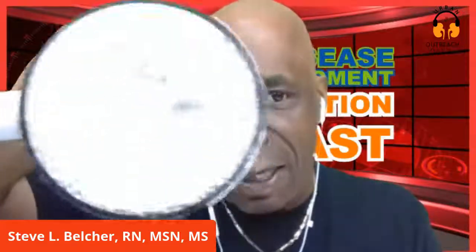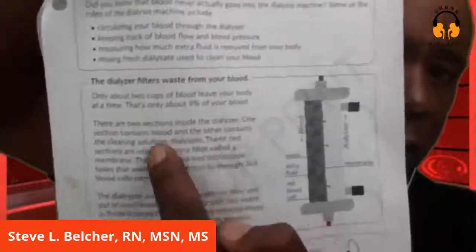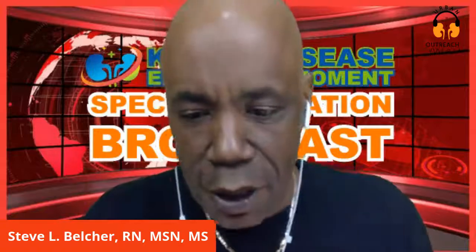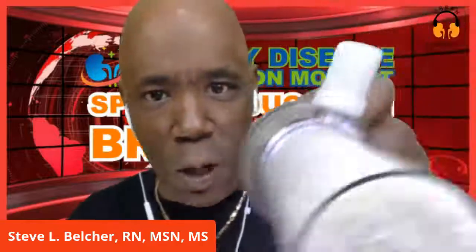The dialysate pulls waste through the filter and out of the blood. The dialysate with the waste is flushed down the drain and the clean blood is returned to you. Extra fluid in the blood is removed in a similar way. You can see that right there - that's what your blood goes through. You've got your blood that goes through, the dialysate comes up through this part, and that's how it works.